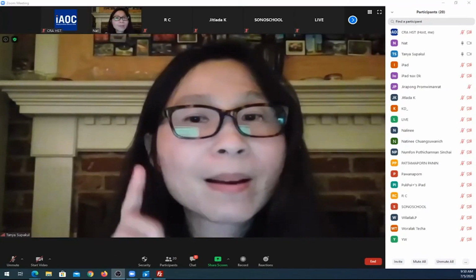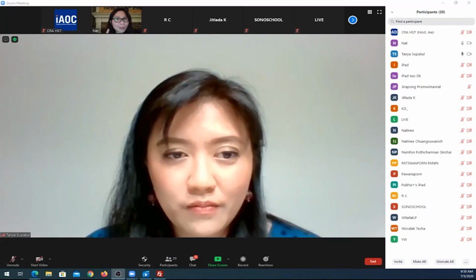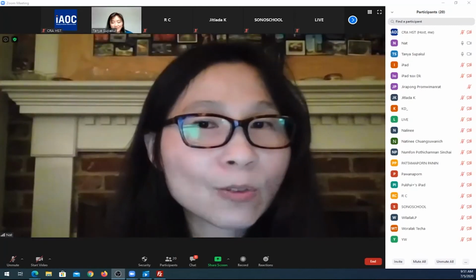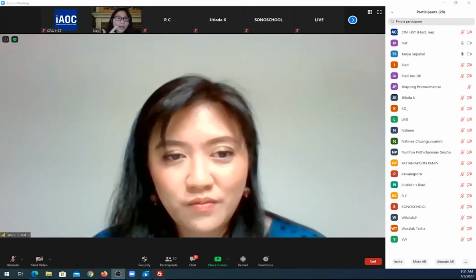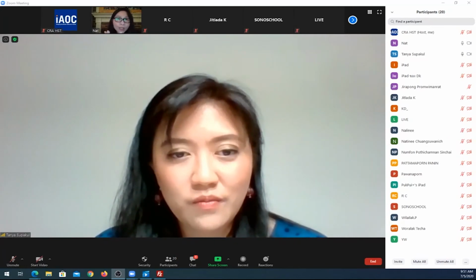Don't forget, even if you have good enhancement, it doesn't mean that you will have a good study. There are a lot of factors involved in image quality: the rate of injection, the concentration of the iodine, and especially motion. Cardiac motion, you cannot fix.